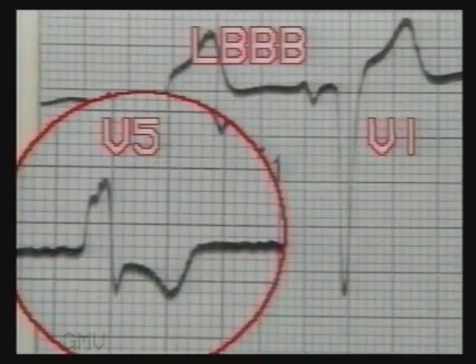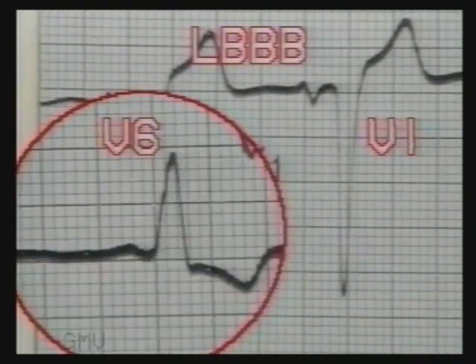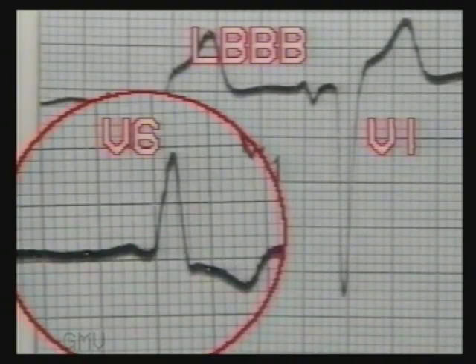This is another ECG of left bundle branch block. See the broad and deep S-wave in V1. The inset shows an RR' pattern in V5. This is a broad slurred R-wave in V6.